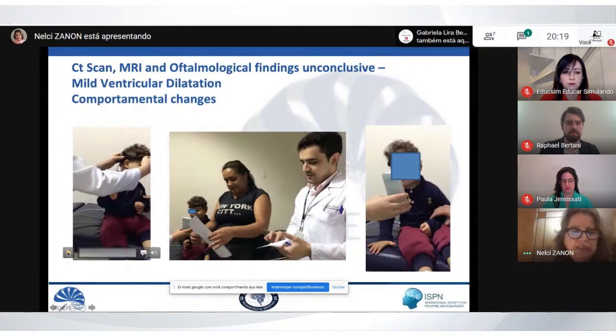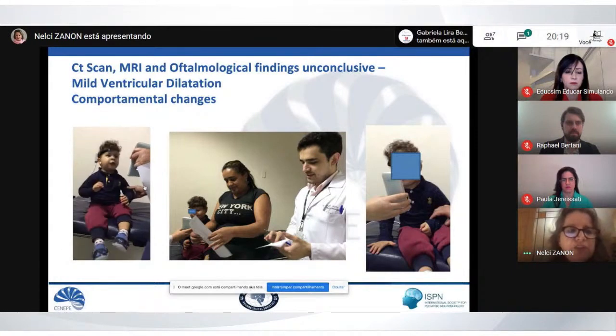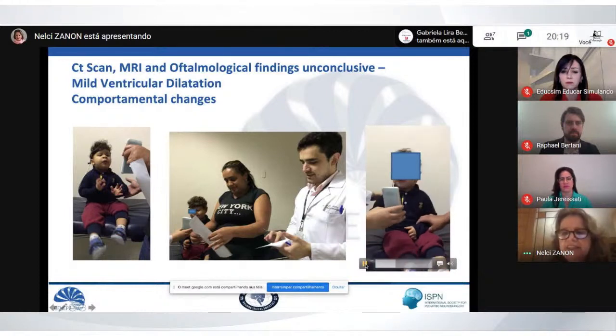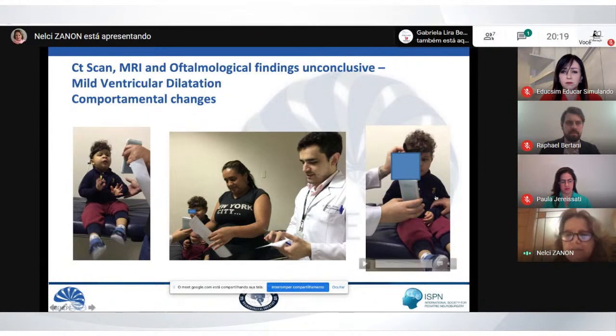When we go to clinical practice, we see, for example, a small baby, we just try to monitor him, but he has some movements, which is a limitation for us. We cannot be sure that our monitoring is perfect.